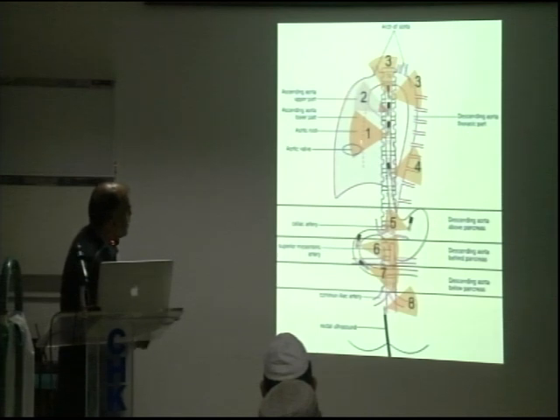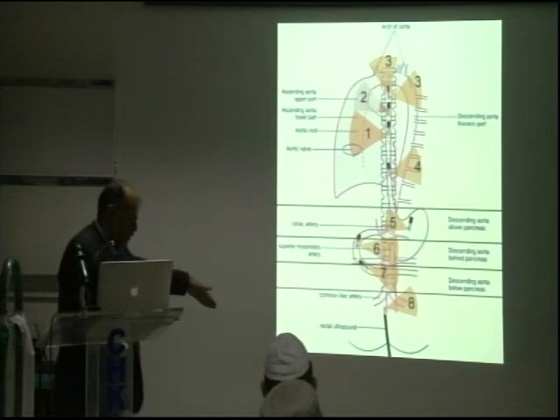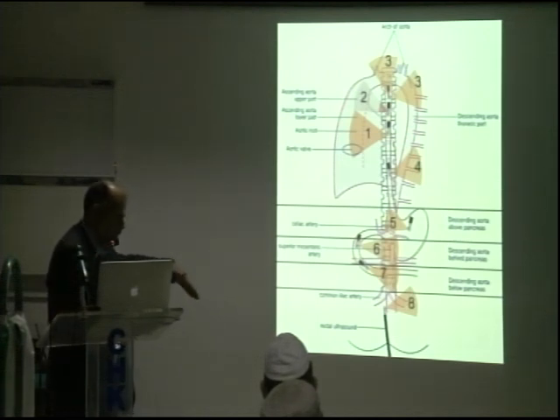All right. So as I said, as Dr. Khalid also said, if you do a sweep here, you can actually look at all these things in one go. That's what he was talking about when he said that instead of looking region-wise, yes, you can do region-wise, but you can sweep it and you can look at it all, right?